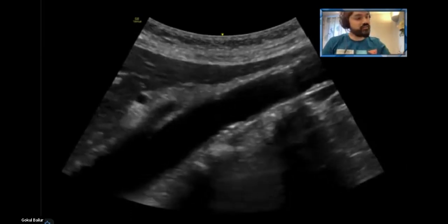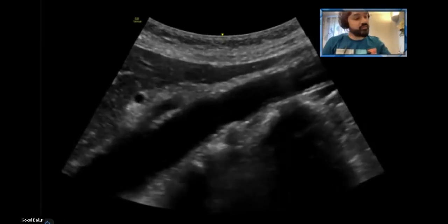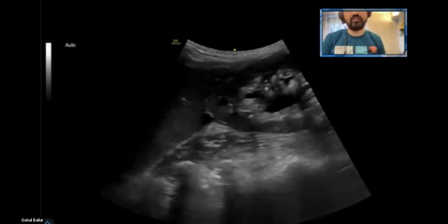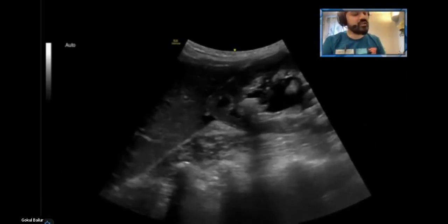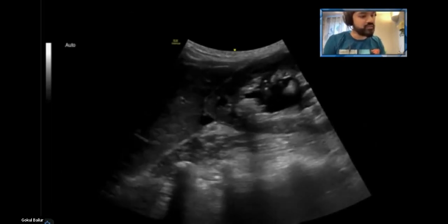So why does she have right iliac fossa pain that's going down the back? And why was it 10 out of 10? So I went ahead and did a right-sided Morrison's, like an EFAST kind of scan. I'm at the mid-axillary line on the right side, and this is the first image I can see. Can anybody see a pathology or something that they're worried about?